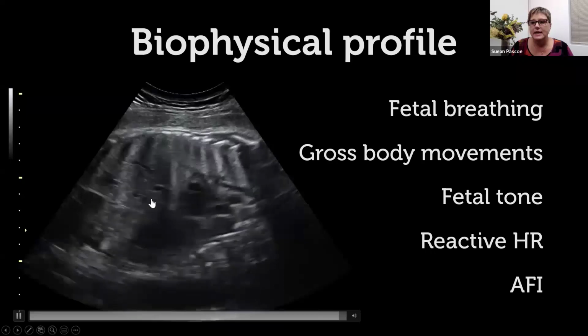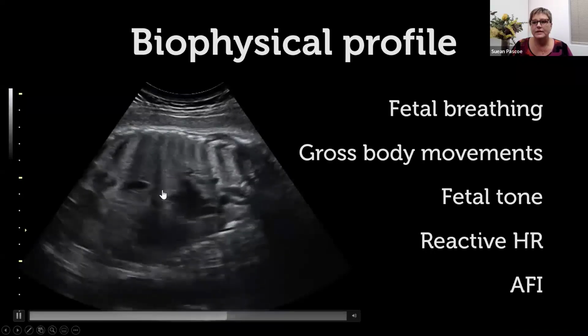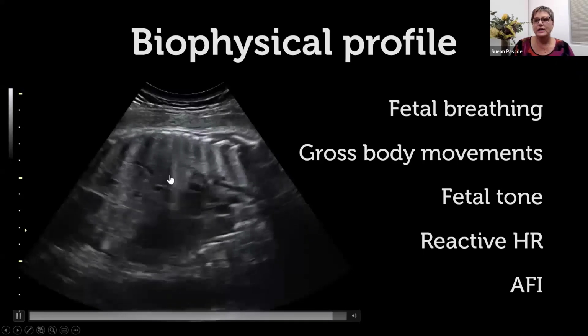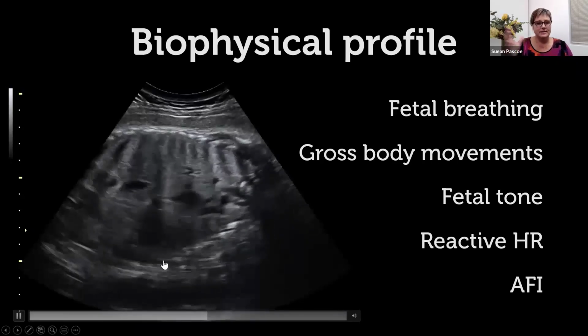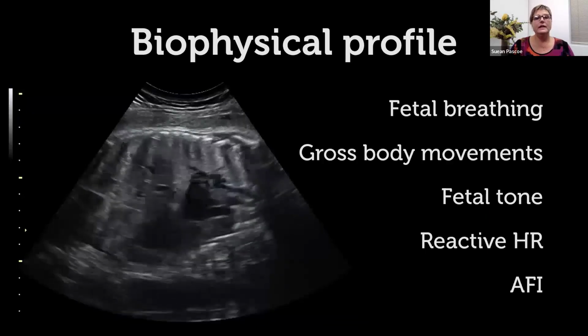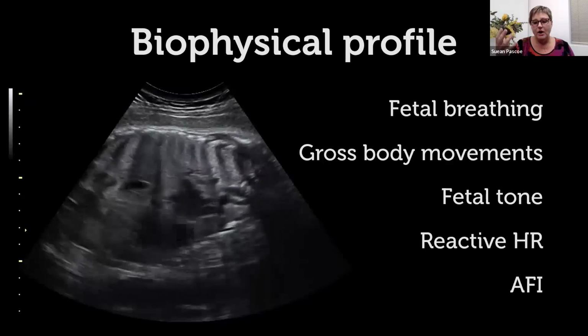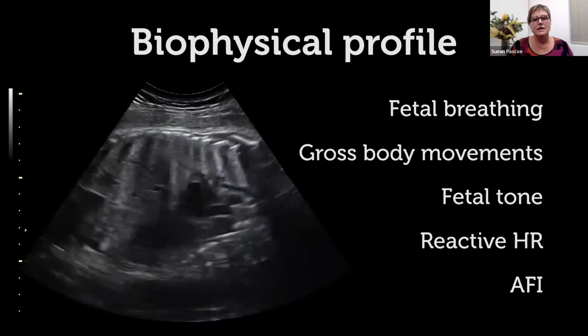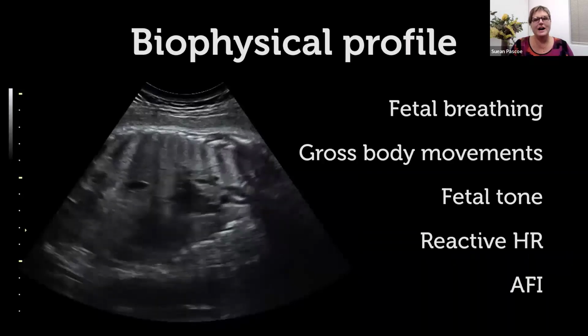So on this example here, we're watching, we can see Bub, you can see Bub panting and breathing there. So we're looking at the diaphragm, and you can see the movement of the diaphragm here indicating baby's breathing. And then you have to go and find each of the feet. You might be on one hand and it flexes and extends the other hand, and so you miss it. So it can be really frustrating when you can't see these things.